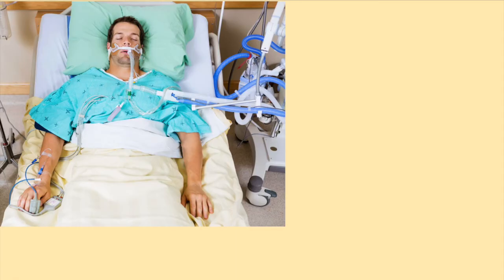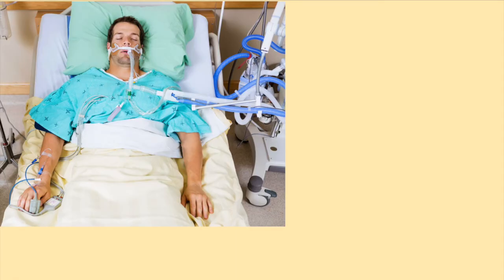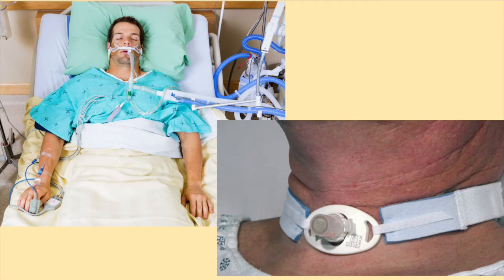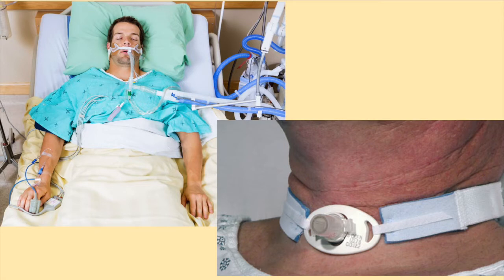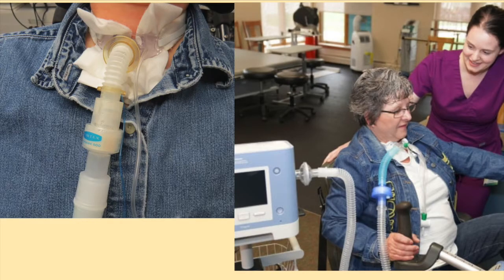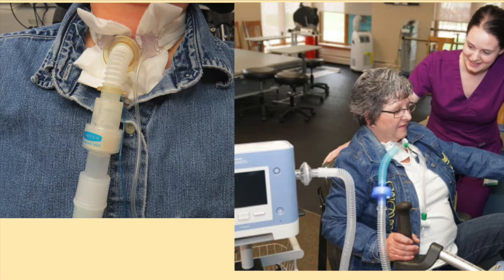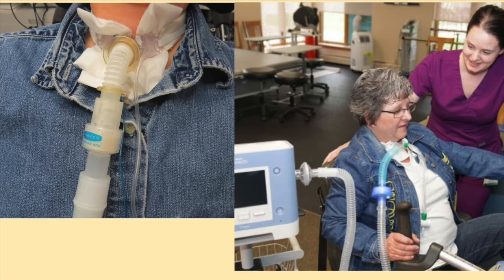Invasive ventilation involves inserting a breathing tube into the person's airway. The tube can be placed through the person's nose or mouth, or it can be surgically implanted into the patient's neck. Once the breathing tube is in place, the patient is connected to a ventilator. This type of ventilation is called invasive ventilation.